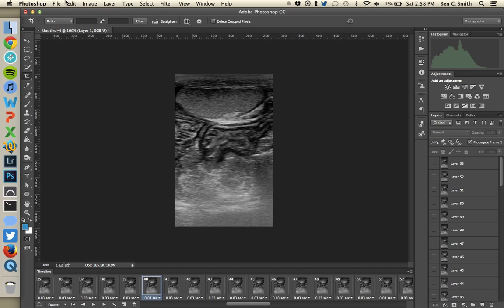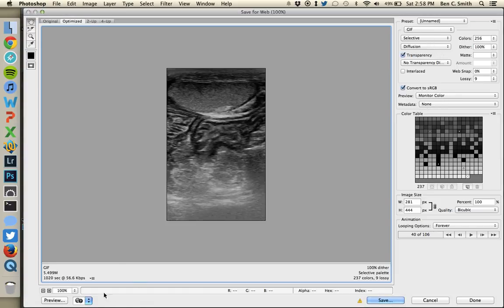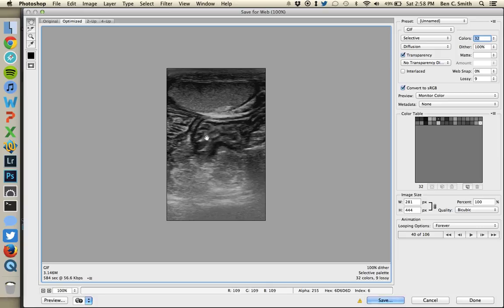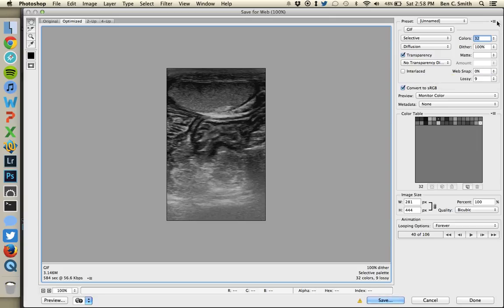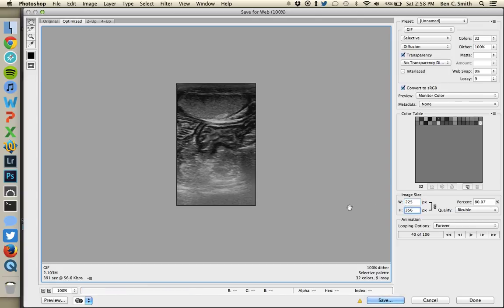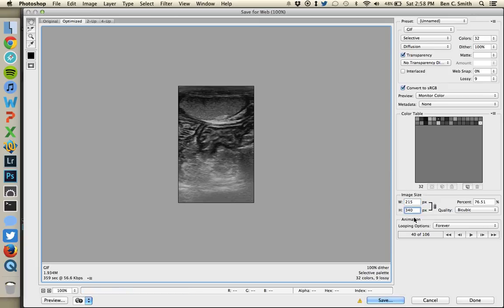Hit the space bar to stop the animation, then go to File > Save for Web. GIF is selected. The size is 5.49 megabytes — a long way to go. Since this is a black and white ultrasound image, I'll drop colors way down to 32. The image barely changes in appearance but file size drops to 3.1 megabytes. I try 16 colors — it gets a little grainy. I'd rather have a quality image at a slightly larger size, so I go back to 32 colors and reduce the image size instead. At 215 pixels wide, the file size calculates to 1.9 megabytes — good to go.